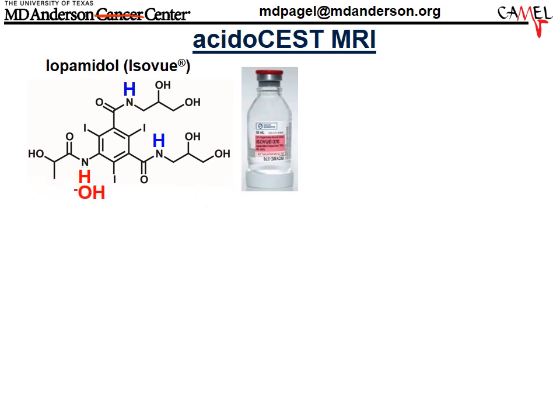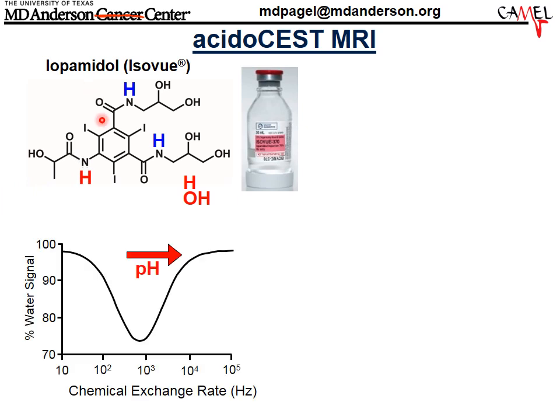And if a hydroxide ion comes past the agent, that can remove a hydrogen from the molecule, and it gets replaced by another hydrogen atom. That causes the chemical exchange to form a water molecule, but really driven by this hydroxide ion. So it is a base catalyzed event.